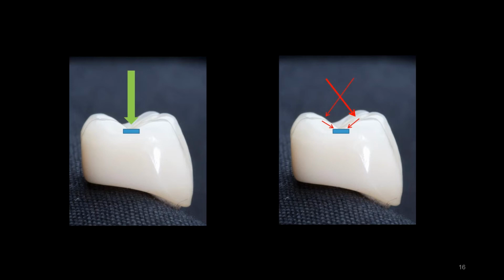You have to appreciate this could be the width of a human hair or the discrepancy of a human hair. They can't feel that. And that is what causes the problems for us. It causes the shift or the wiggle or the damage. We expect a patient to accurately find Centric each and every time when they can't feel their teeth touch. And now most of it is going into senior citizens that have a degraded neuromuscular system or are on medications. As we age, our neuromuscular system and how the muscles fire become less accurate. And yet we expect that. When we set up denture teeth on an articulator, we pinpoint Centric and everything is precise on an articulator, and then wonder why we have troubles in the mouth afterwards.